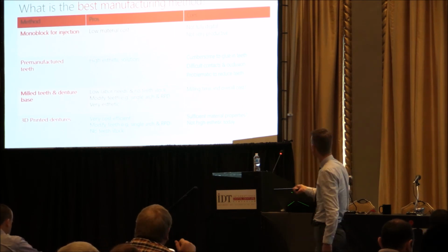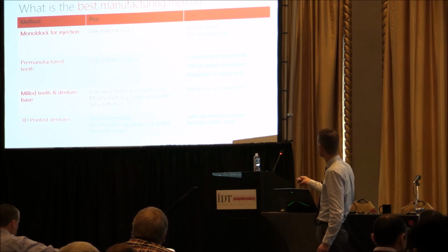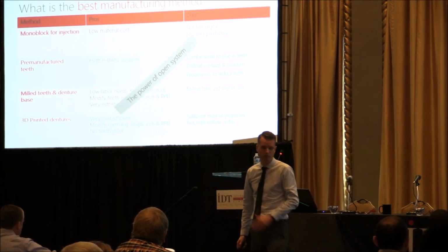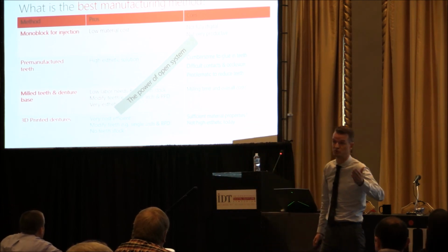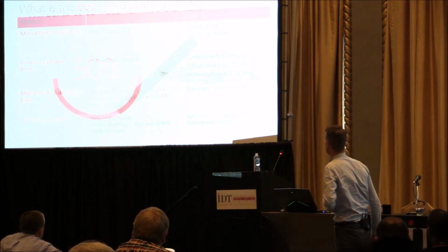Isn't it a dream? Over here, milling time and overall cost: is that good enough? Time will show. Is the material good enough here? Maybe, but it for sure will be. And again, buy a system that can do everything. Buy the truly open system where you have all the opportunities, because it's not completely clear today which method will win, even though there are some better methods.